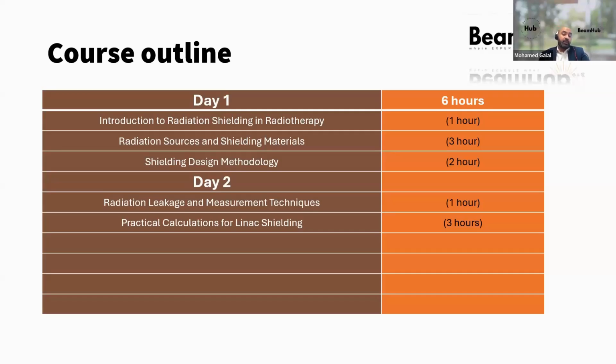Also, in some situations you have a brand new building, so in this case you can calculate the thickness. Sometimes you have a replacement. In this case, you already have a bunker, but you need to validate or calculate the areas behind the bunker. So what to do in this case and that case.